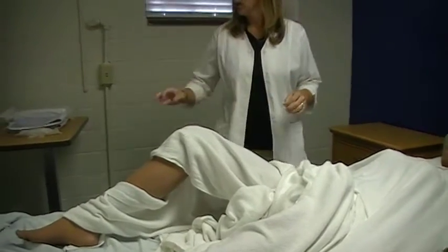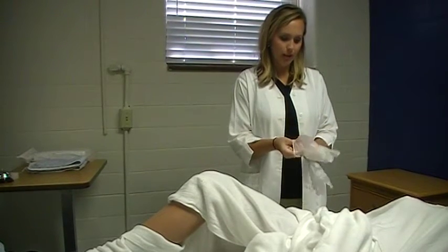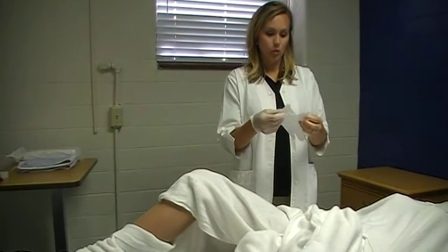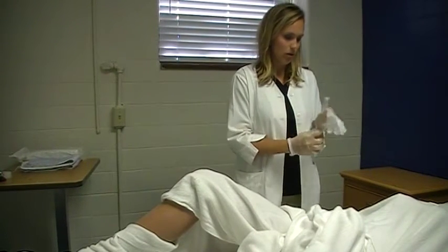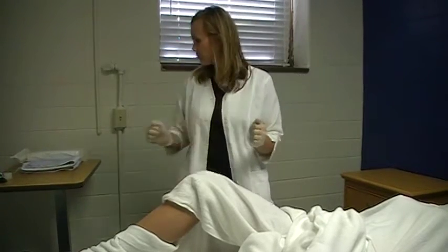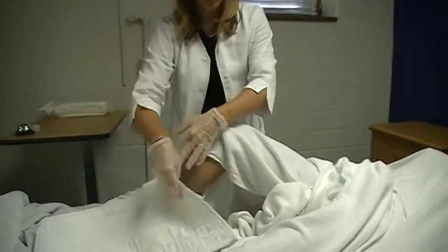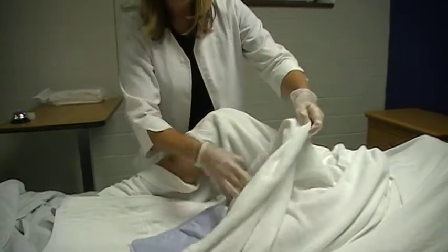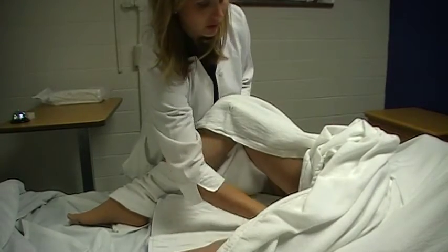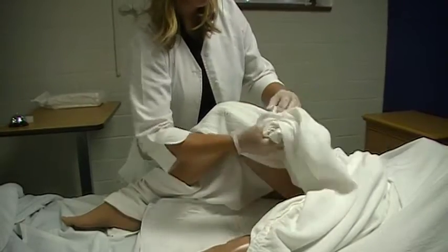We want to don our clean gloves. Any time before you do catheter care — which is a sterile procedure — you want to provide peri care. After donning gloves, place the waterproof pad under the patient's buttocks; you can have her roll over or lift her thighs to slide it underneath. That is to protect the bed.